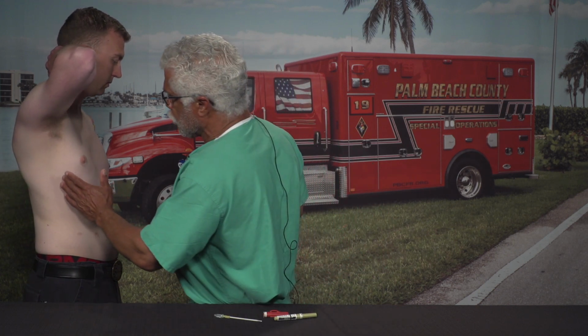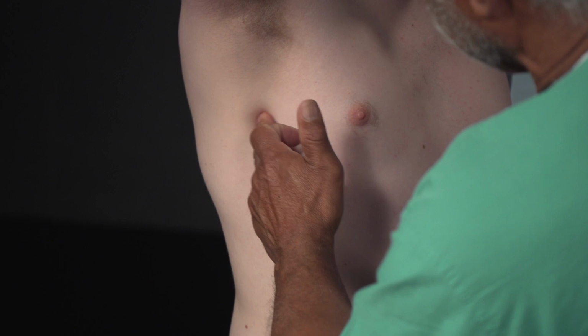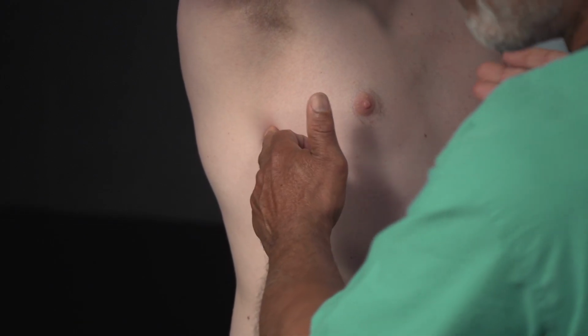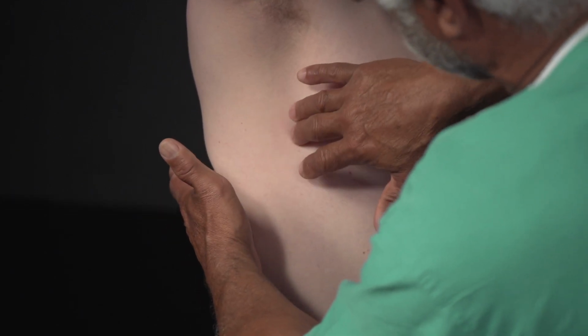If it's a pneumothorax or a hemothorax, this is gonna go real easy. There's no lung there, you're gonna have a lot of space between the lung and the chest wall, so it should be really, really easy. And this is what I'm talking about here. So if you see, here's his latissimus dorsi, here's the mid-axillary line. But right there, I could still feel his lat. Now, even in somebody who's more built than he is, not that he's not built, but somebody who is, this muscle will come up even a little higher up to here.